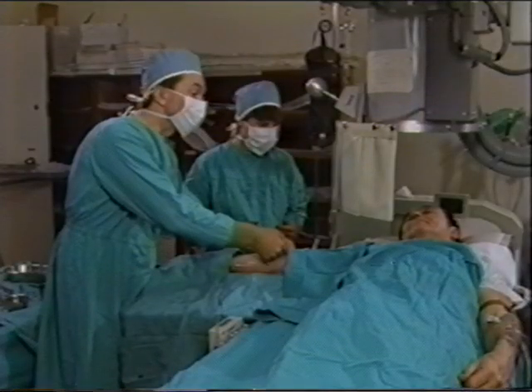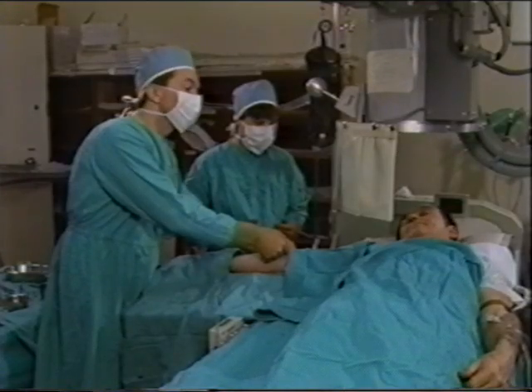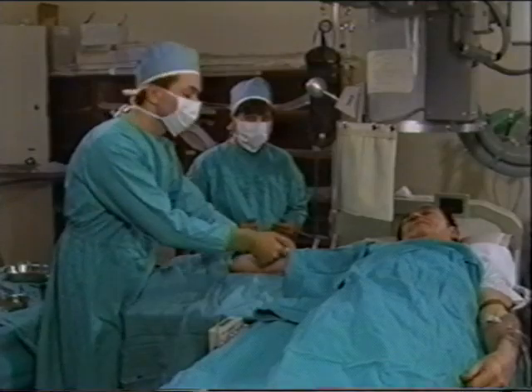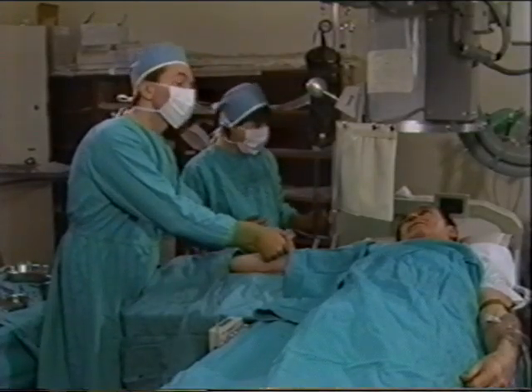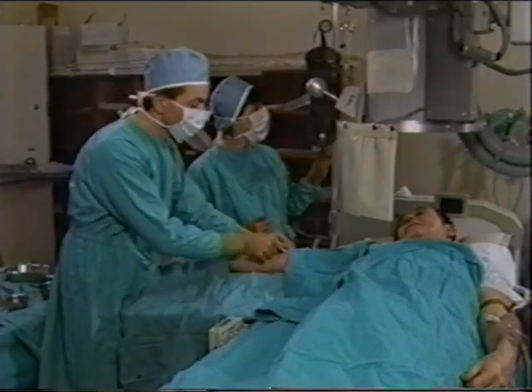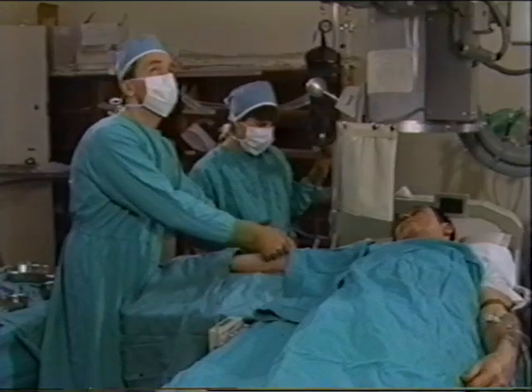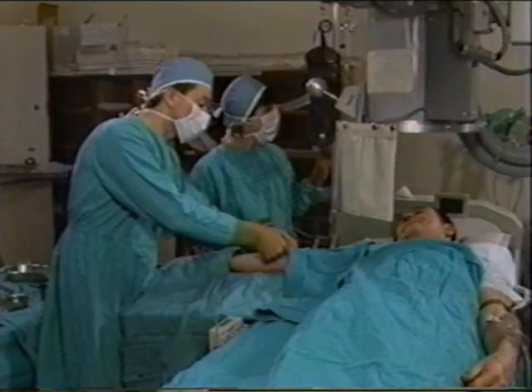Near the end of the catheterization, you may be turned on your side by the rotating catheterization table. You may be asked to take deep breaths or to cough. This helps to circulate the dye through your system. As the dye begins to leave your body, you may feel the urge to urinate. This feeling is normal since the dye leaves your body through your kidneys. Tell the nurse so that you may be accommodated.